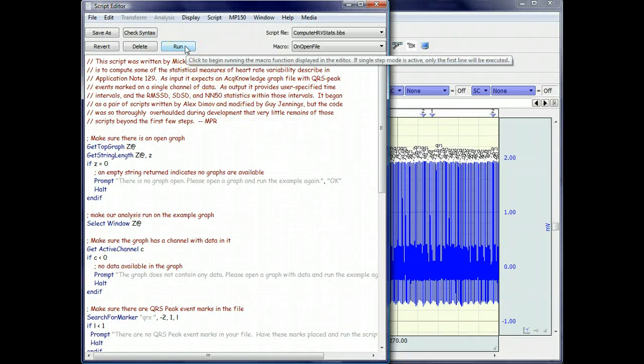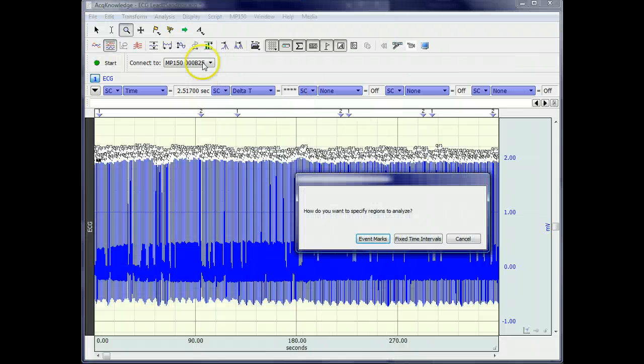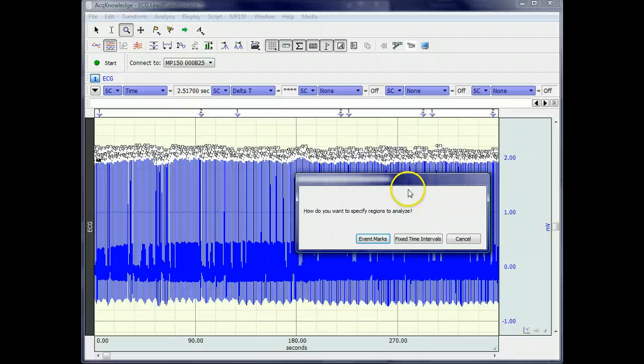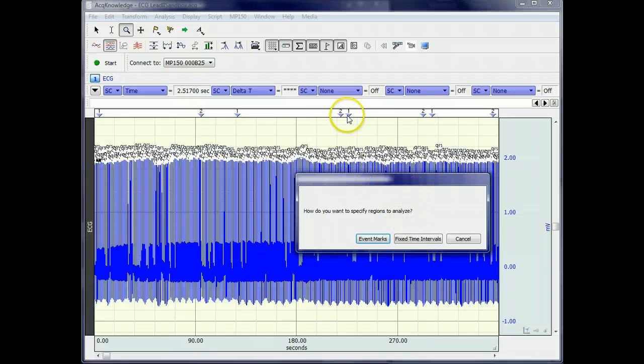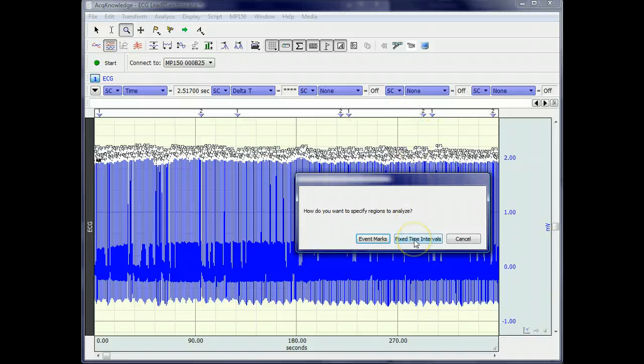When you run the script as it's currently written, the first thing it does is ask you if you want to analyze heart rate variability based on event marks, which is what we're going to do here, which is why we have the events 1 and 2 inserted, or with fixed time intervals.